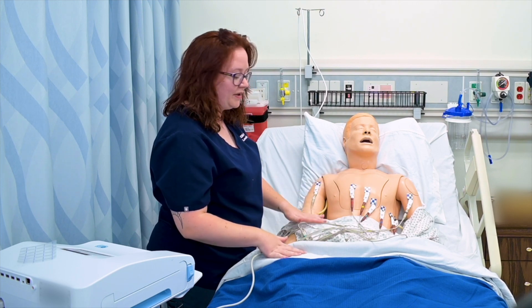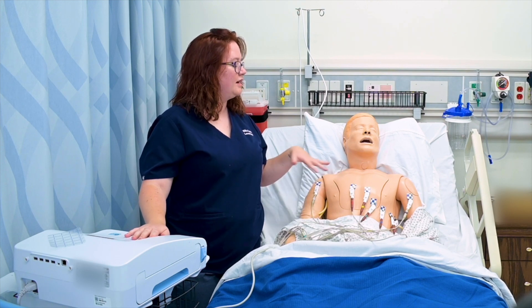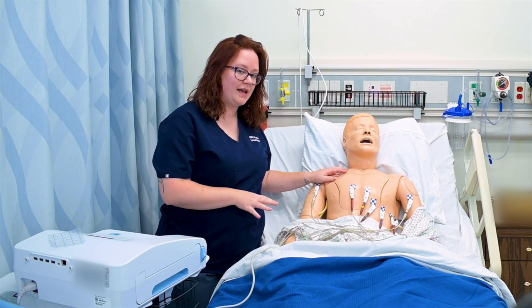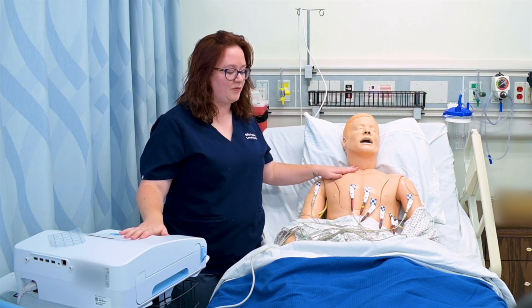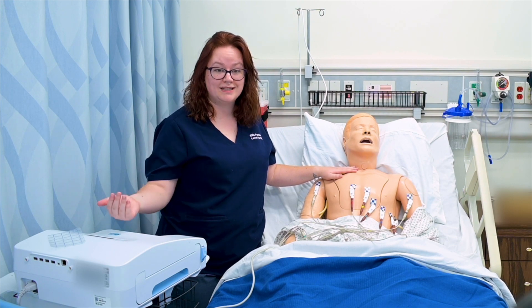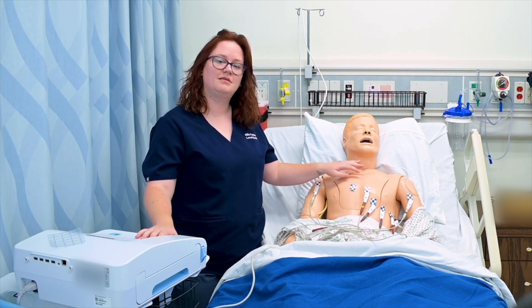Once all my electrodes are placed, I make sure my device is turned on and I ask my patient to breathe calmly and stay still for about 10 seconds. I want him to stay as still as possible because if he moves around, the picture I'm going to get will have artifact on it, which won't reflect what's actually happening with his heart. I'll hit print and my machine will either print it or electronically transfer it to his medical record. Then I simply remove my electrodes and make sure I clean the paste off.